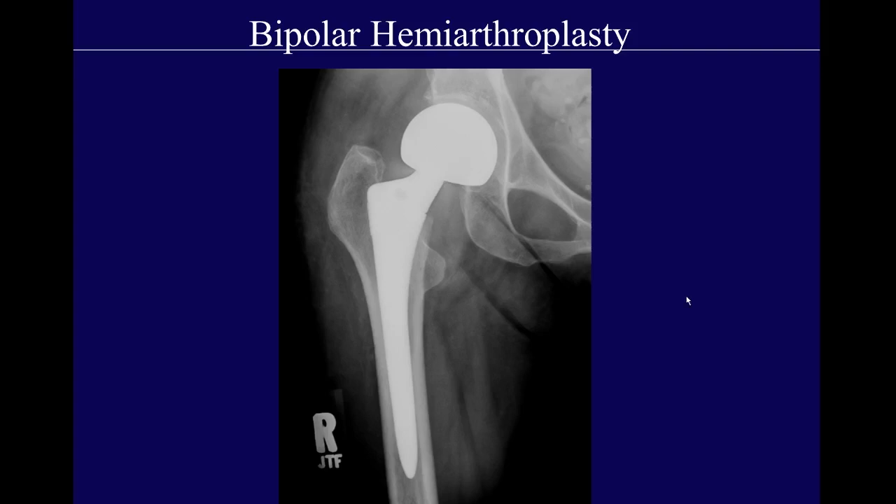In order to protect the native acetabular cartilage, what's often done is called a bipolar hemiarthroplasty. It's still a hemiarthroplasty because they're only replacing the femoral side of the joint, but they'll place a cup in between the femoral head and the native acetabulum. The cup is not fixed into the acetabulum, nor is the acetabulum prepared or reamed in any way — that's why it's still only a hemiarthroplasty.